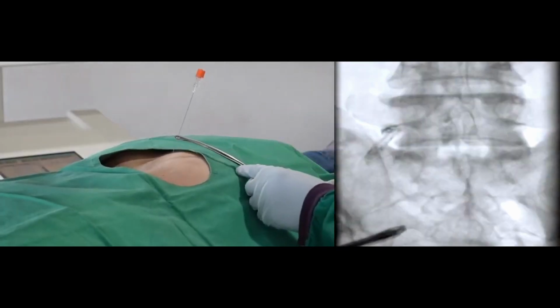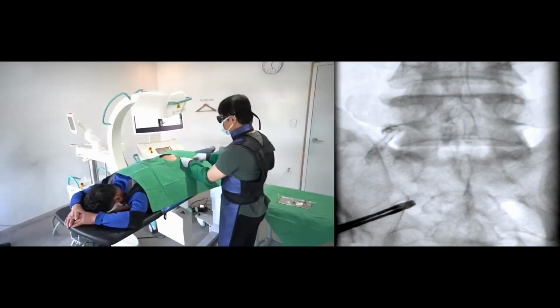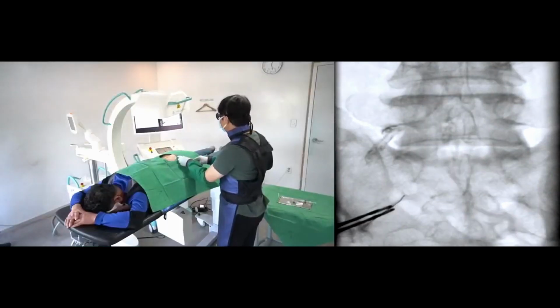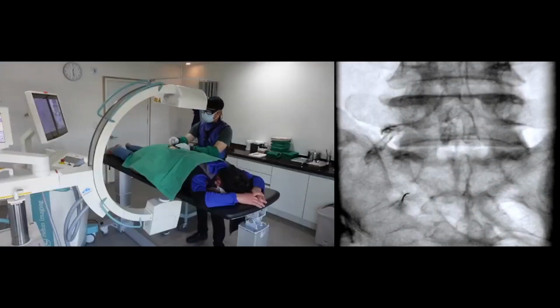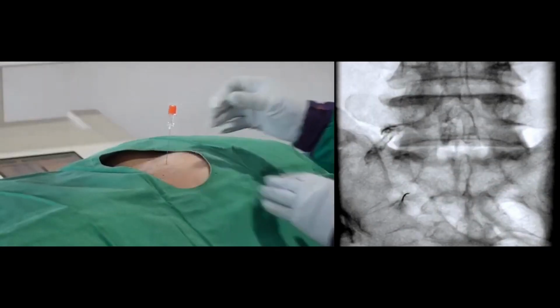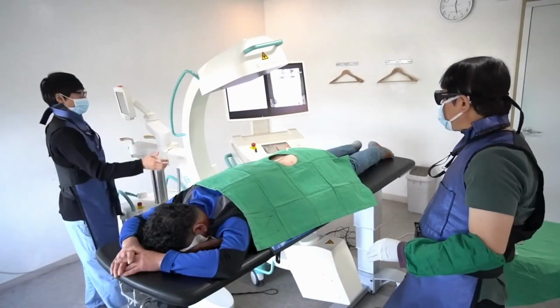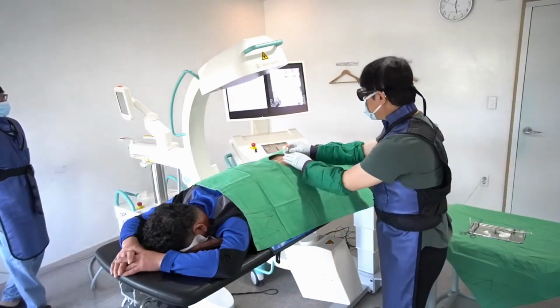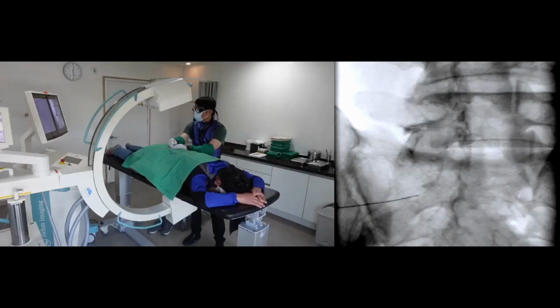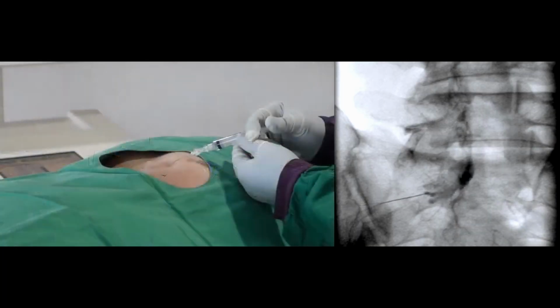Next, I'll transition to the S1 nerve root block. I'll rotate the C-arm cranially and mildly ipsilaterally. The most efficient way to identify the posterior foramen of S1 is to locate the pedicle of S1 and the radiolucent hole adjacent to the pedicle's inferior and medial borders, and then rotate the C-arm to a contralateral oblique position. Identify the pedicle and the yellow line below the pedicle of S1. It appears straightforward, doesn't it?